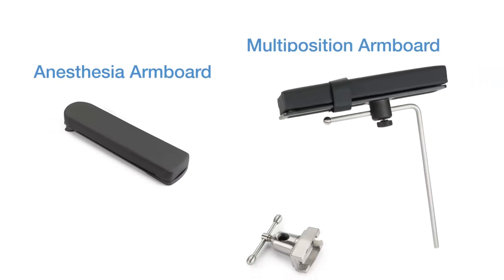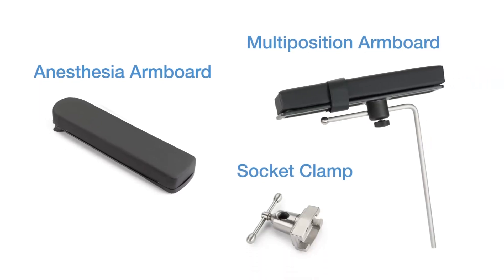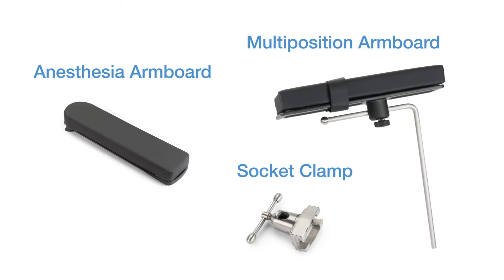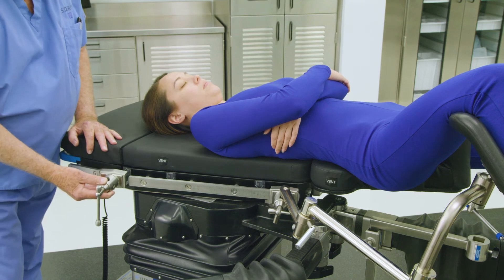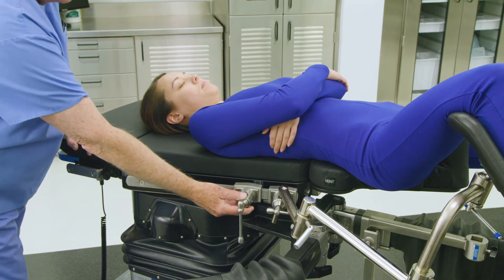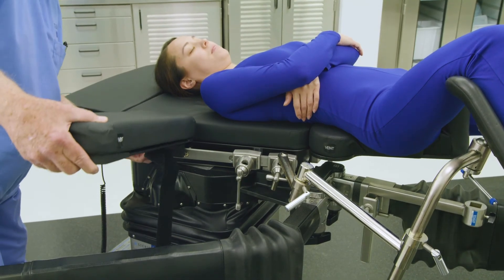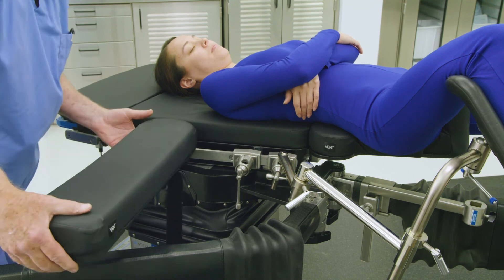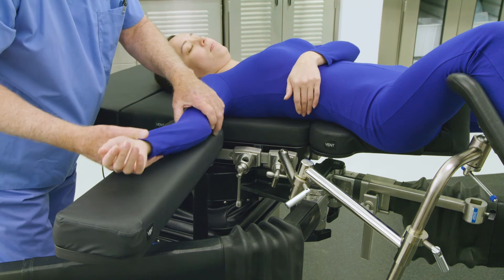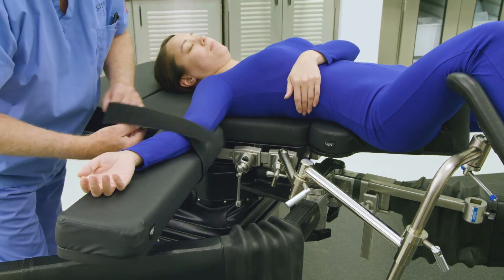The OT-1000 series table is equipped with both an anesthesia arm board to help position the arm on the non-operative side and a multi-position arm board for the operative side. Before attaching an anesthesia arm board, first apply a socket clamp to the side rail on the non-operative side of the table. Next, apply the standard anesthesia arm board to the side rail on the non-operative side. Adjust as needed to accommodate proper arm position, and apply the safety strap to secure the arm.